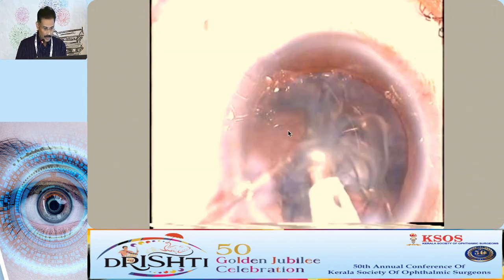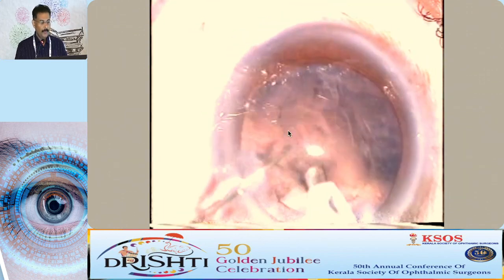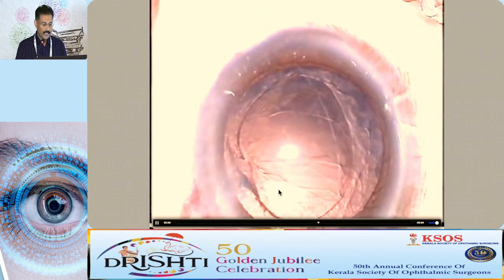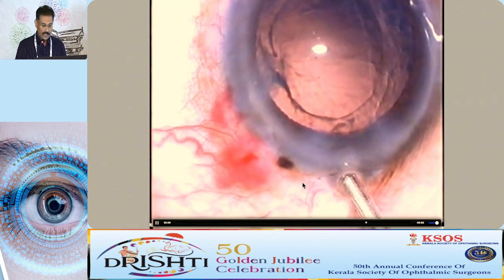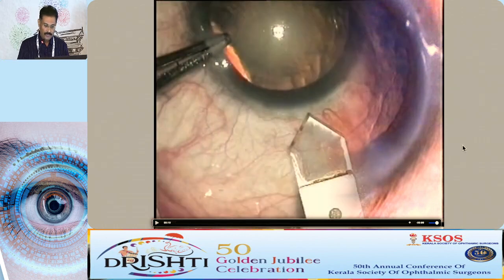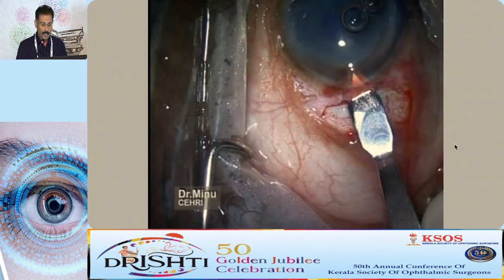This is the one in which, see, happily we'll be phacoing, but at the end of the day, when you take it out, you will see something like this. This is a phaco burn. It's a small burn. Still, it can cause difficulty in closing the wound. It can cause astigmatism. So if it is not closing, definitely put sutures till you find that it has closed completely.